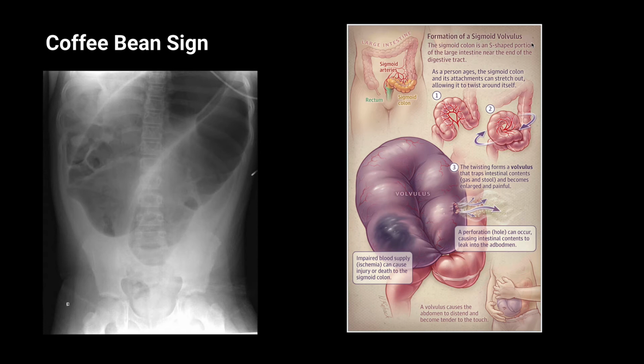And that appearance, again, can be extremely ominous, not simply just because of the distension, but as well that the distension implies that there may be compromised blood flow to that large bowel, giving it a higher risk of perforation, ischemia, and potentially sepsis and infection for that patient.